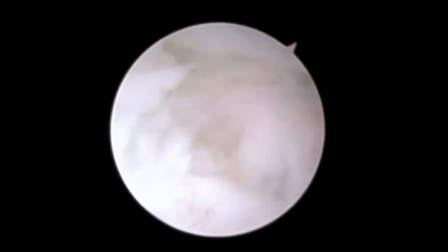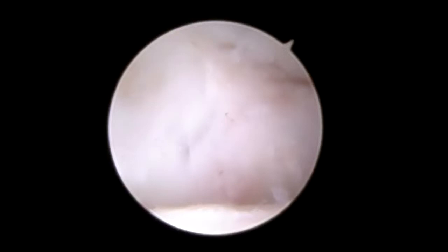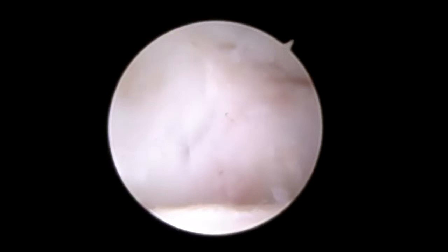The joint has been cleaned out — nice wide open space, no tissue enfolding into it. Inflamed tissue has been removed. There's the edge of the intact ligament there, you can see. All done.